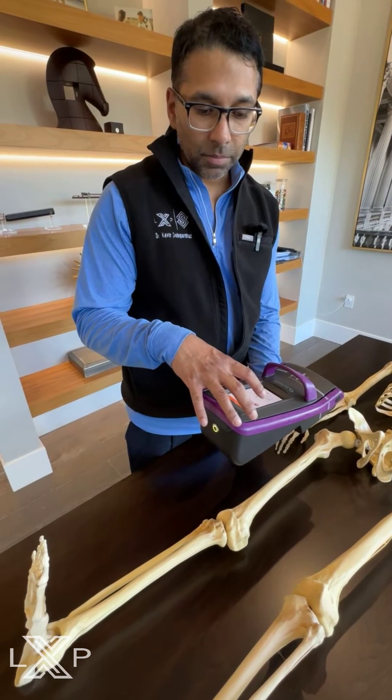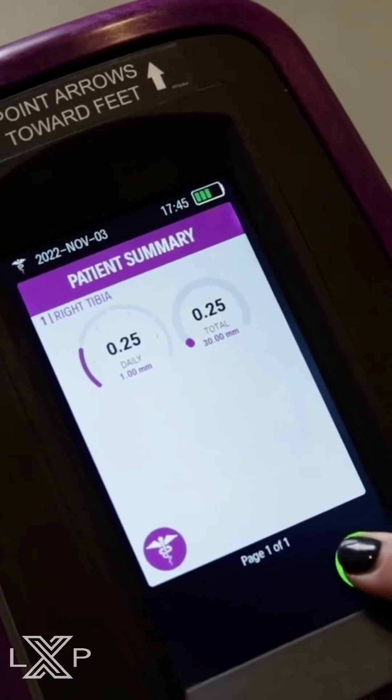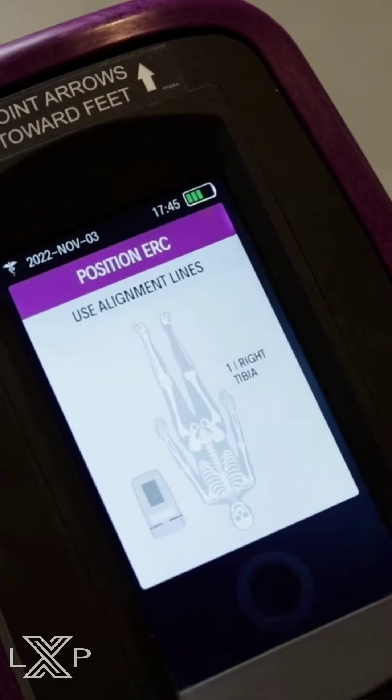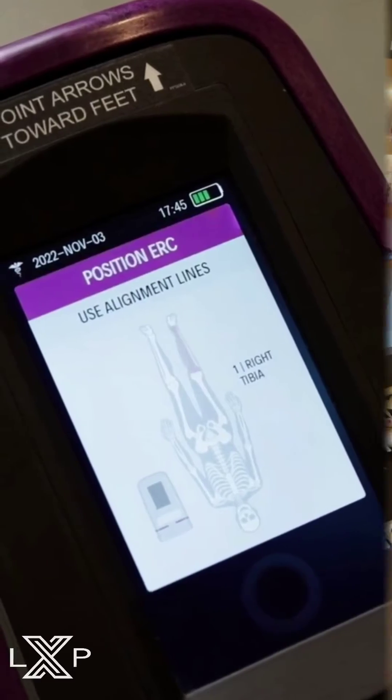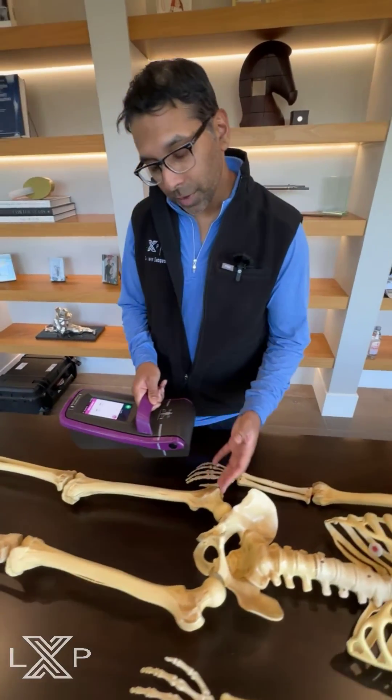That's then digitally monitored through the device itself, so it will track how much length the patient does, what sequence, and this will be programmed by the actual surgeon. The remote control is then utilized by the patient. It's very easy to use and it's available in different languages.